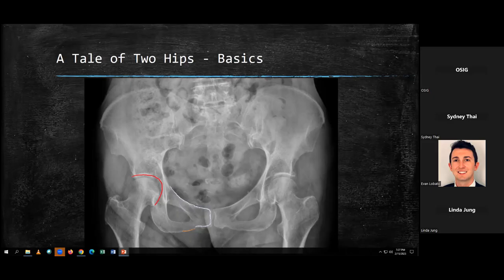Acetabulum, that's in red. Femoral neck, that's there. Trochanter, so greater and lesser. There's also the entire pelvis, the ilium, the ischium, the pubis, the pubic ramus, as that's what's highlighted. This is a plain radiograph, X-ray, AP pelvis.